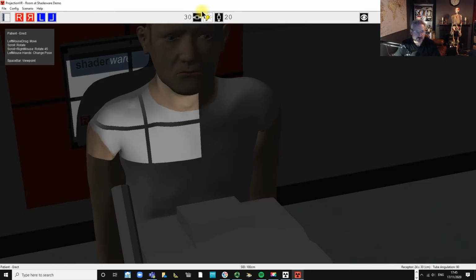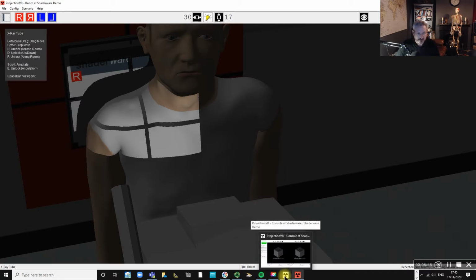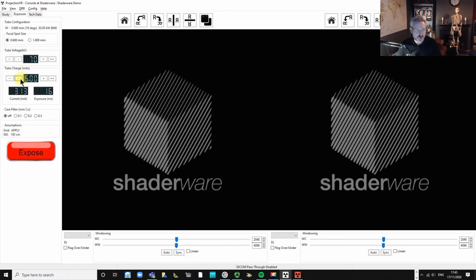So I'm just going to collimate in a little bit more, because there's no need to be any more than that, and I'm going to pop the marker up here so there's no chance of it sitting over any anatomy that I might need. Okay, so happy with that. So I'll give the patient some instructions, tell them what I'm going to do whilst I go behind the screen. And this, we would just see arrested respiration, so we'd just say to stop breathing rather than breathing in, because if they breathe in violently then they'll move, so we don't want them to do that.